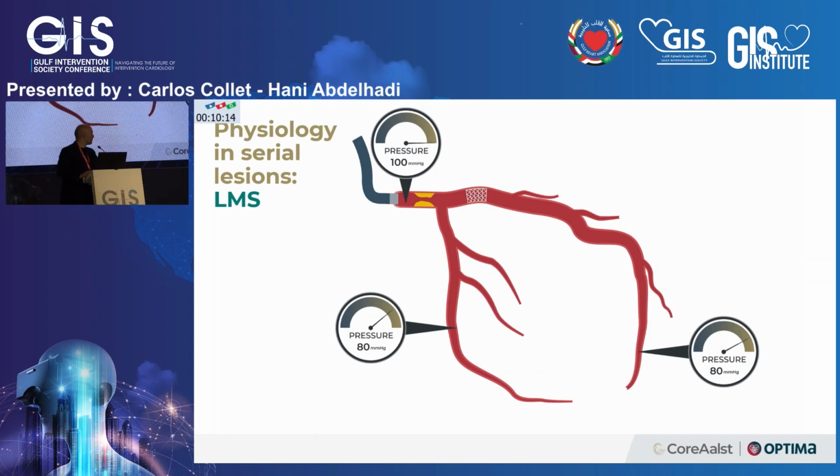No, the FFR in the circumflex, let's say you have a very critical stenosis in the proximal LAD, which a lot of flow goes through, and you completely remove the stenosis and increase the flow. The most we have seen the circumflex change is about 5 FFR units. So if you have a 97, the threshold was good, you will go max to 91. But of course, if you have an 82 or an 81, and you treat the LAD, that certainly can go below the threshold of ischemia.